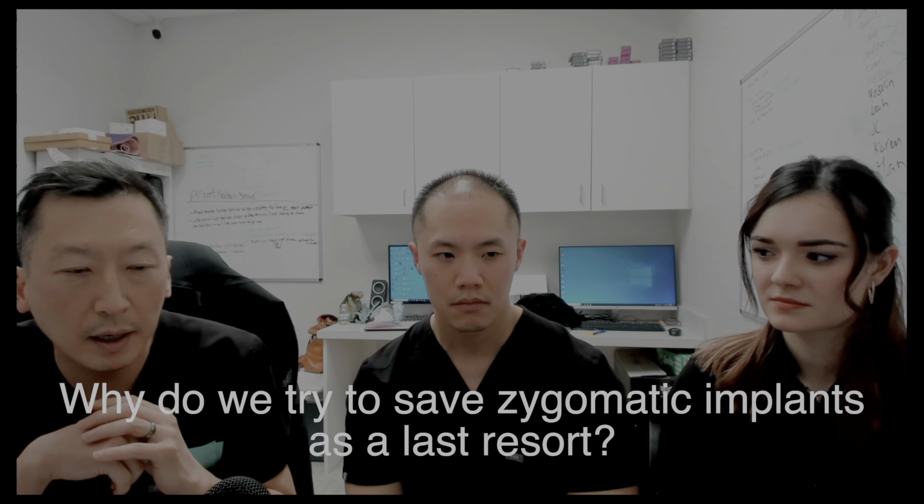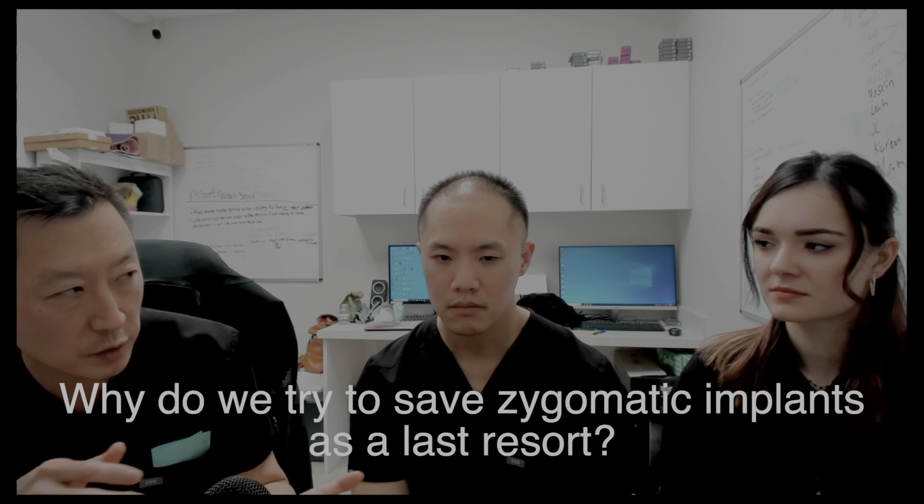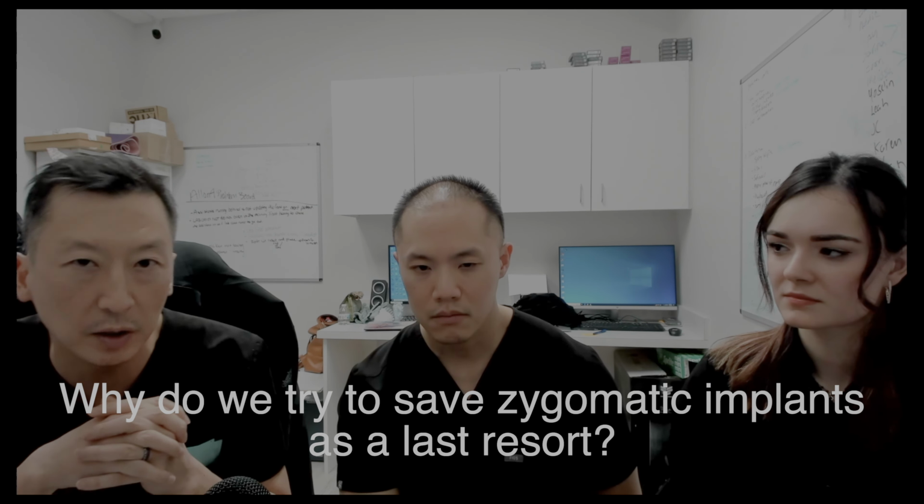But we're going to show you other examples where I actually did combinations of pterygoids and sinus lifts, and I was able to avoid zygos because these patients were younger. So we wanted to touch upon the zygomas, and like we mentioned, why would you want to try to save it as a last ditch? So your cheekbone is, and not on every single patient, some people have very thick cheekbones, some people don't. So some people are better candidates for this. But the cheekbone is a great option to resort to in the event that you have implant failure, right?